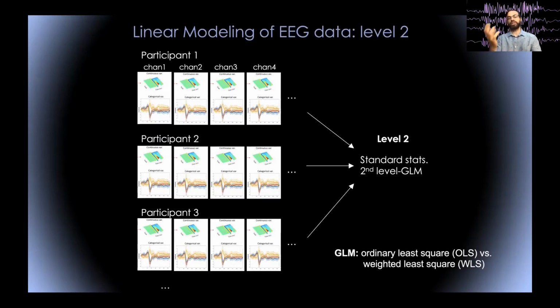And in the lecture that's specific to this plugin, we discuss what's the advantage of doing that versus doing a mixed model where you do a GLM on all the subjects at once and all the electrodes, etc. And basically the main advantage is computational. So we review all of this.